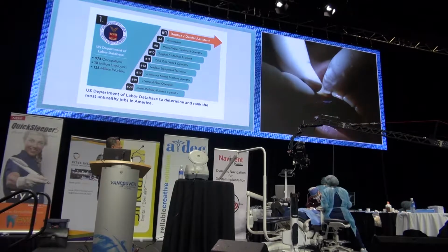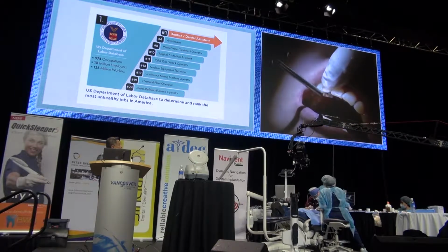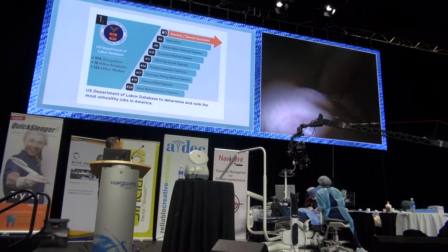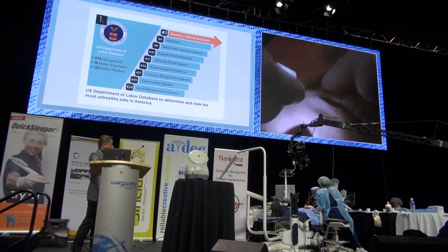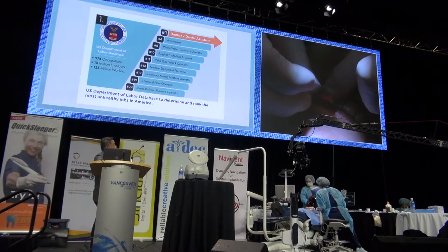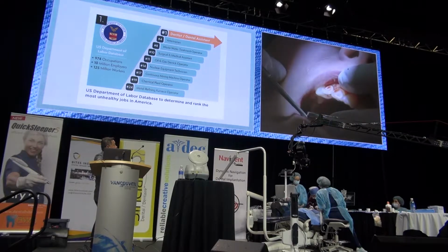So again, the beauty of this is that it holds the soft tissue profile, and the patient benefits from it. There's the shim stock, it's got to pull right through. And ideally, the other canine, or the canine next door, can take the load. The canine can lock in the MIP at 13 microns, but not your implant provisional. On all excursive movements, the envelope of function, make sure there's no loading onto the crown.